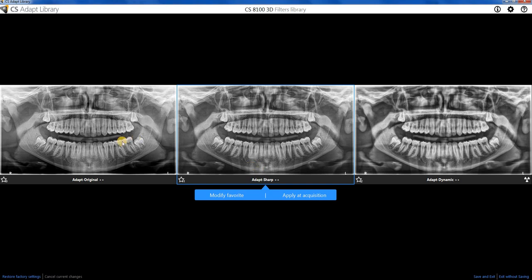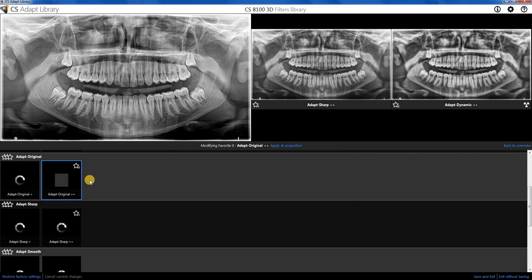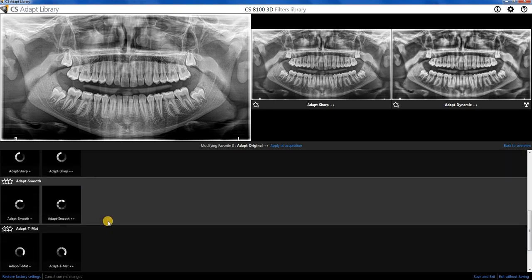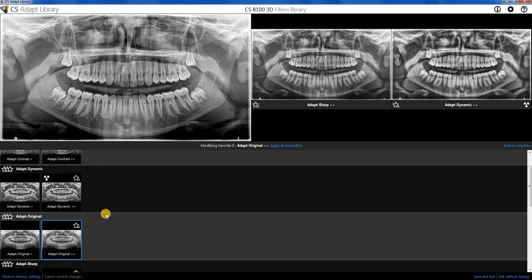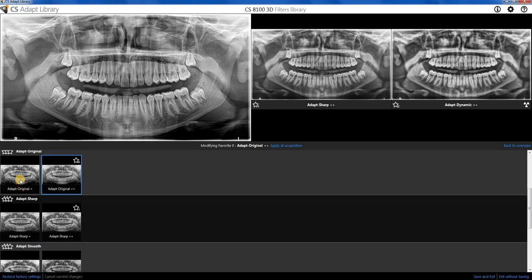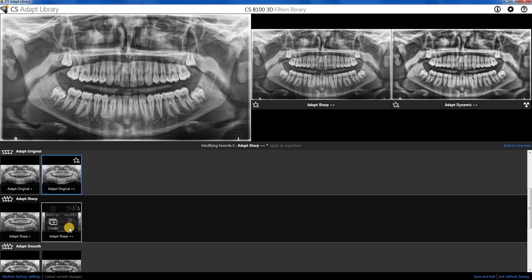Once CS ADAPT is launched, we're going to choose the image that we want to modify. In this case, we're going to click on modify favorite. If we use our mouse wheel, we can scroll up and down and actually take a look at all the filters that we have available. And if we hover over those images, it's going to give us a quick snapshot of what that looks like.